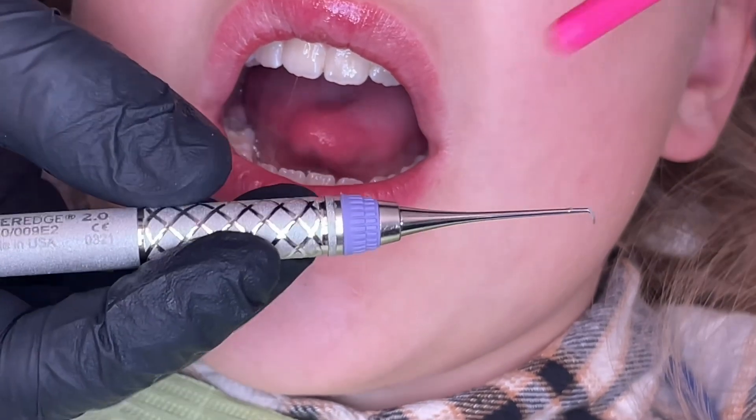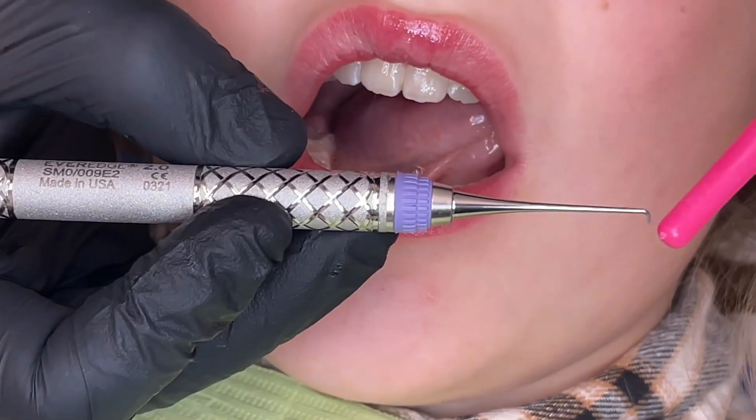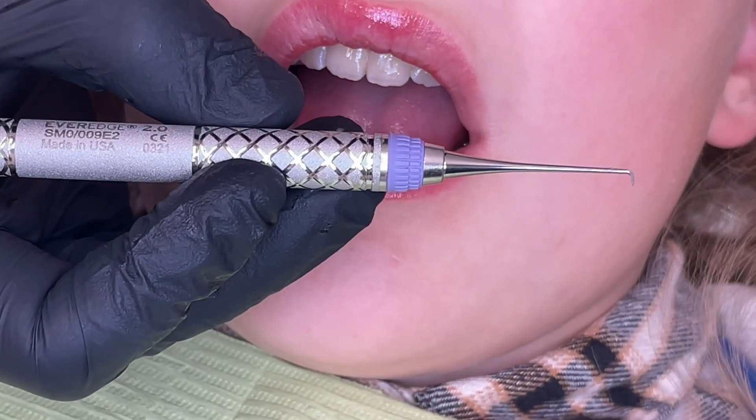So this instrument is pretty handy. If you notice, it's a simple shank — it's straight, and it has a little tiny cutting edge. It's called a SMOO, or SMOO, depending on who you talk to.